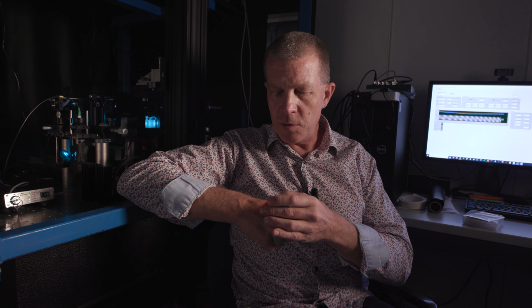The repair idea is to develop such material to obtain patches able to help a diseased heart and restore the cardiovascular function. In the project, we aim to develop light-activated contractile patches which can be sutured onto the exterior of a heart and in such a way assist a sick or diseased heart. The films are very thin. They are in fact only 10 micron thick, which corresponds to 1/7 of a human hair.